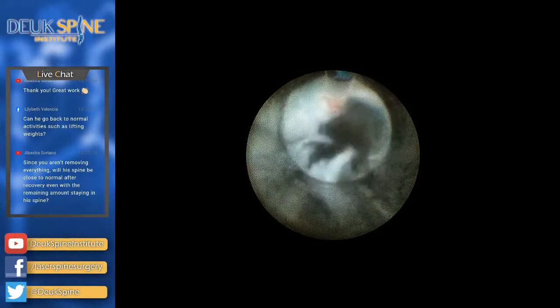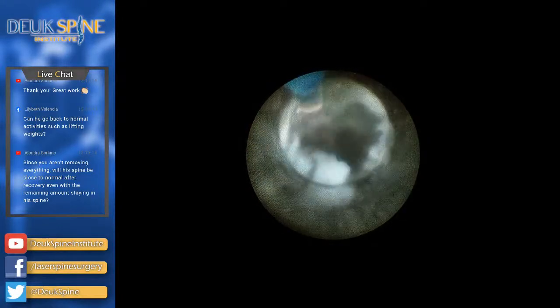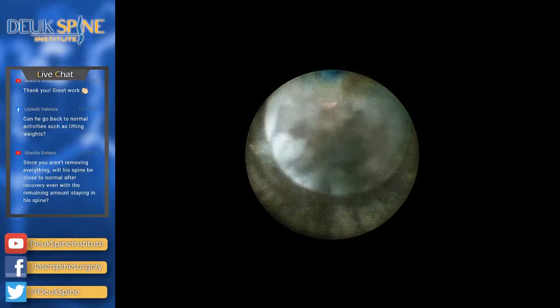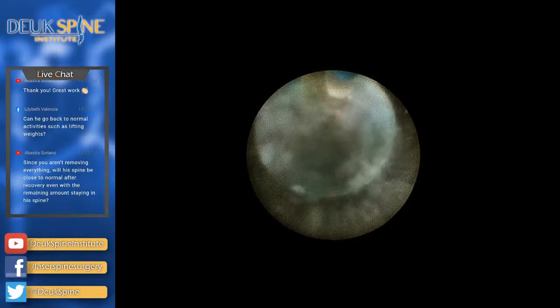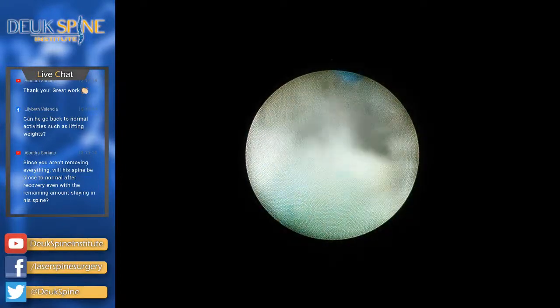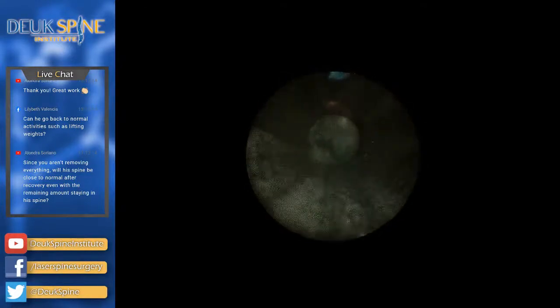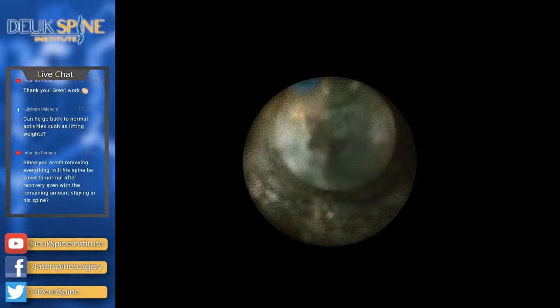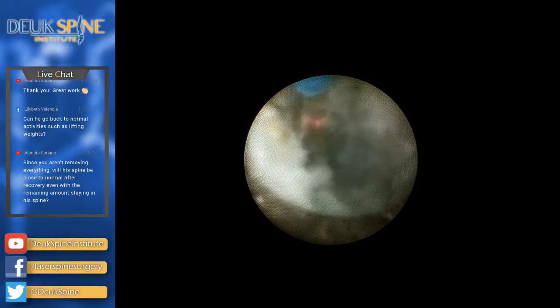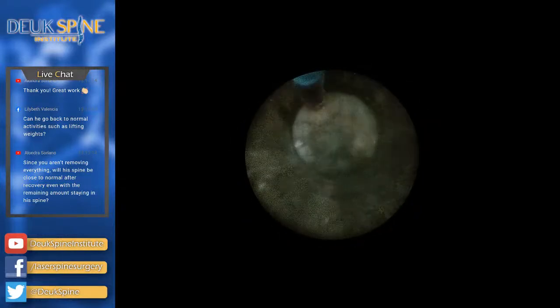All right, just about done. It's taken a lot longer than I thought, and that's fine. But I want to make sure we get it right. There's a lot of scar tissue in this outer part of the herniation because there's more blood supply here, right? So I want to make sure we get it. And then we're going to move to the other side. Very scarred up. All that scarring happened before I got here, obviously.